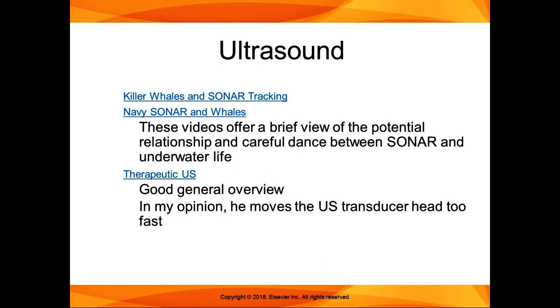So it was initially used for its thermal effects, and then subsequently it was found to have non-thermal effects as well. And a lot of the therapeutic applications have been developed over the last 20 years for using these non-thermal effects. So the non-thermal form of ultrasound is the low-intensity pulsed ultrasound, and then the continuous ultrasound is the thermal form of it, and we'll talk about that a little bit.